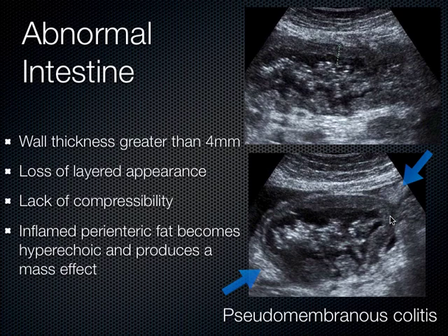And so anywhere in the body with ultrasound, whenever there's inflammation, it appears as hyperechoic areas. That's how inflamed tissue looks.